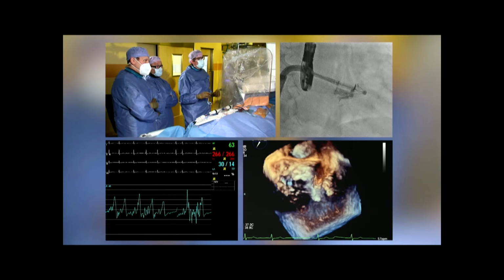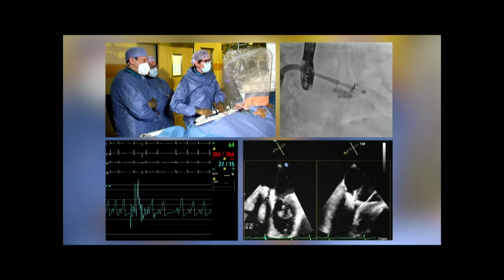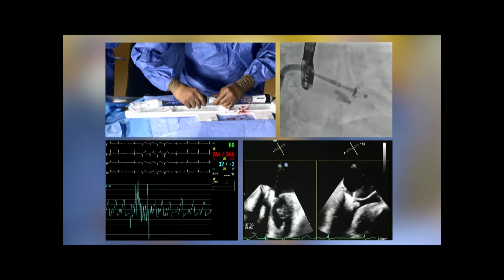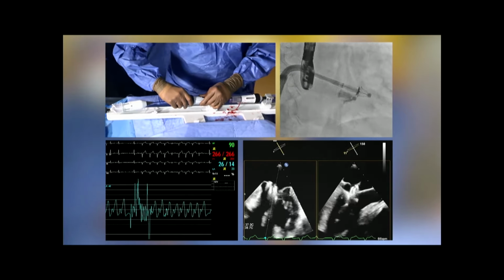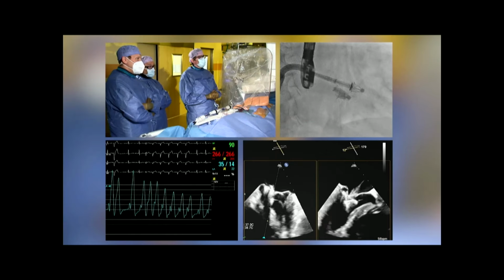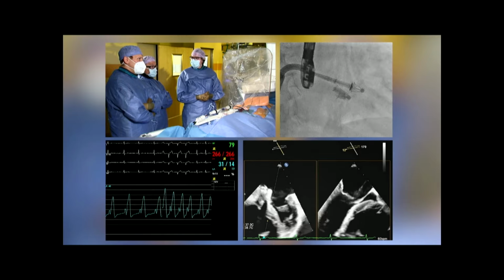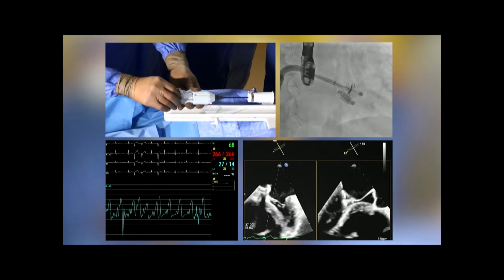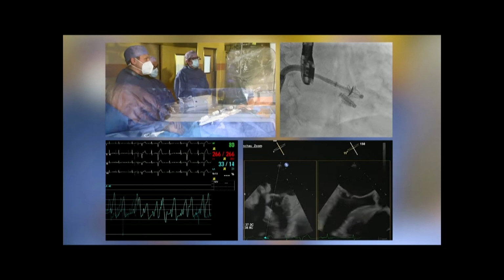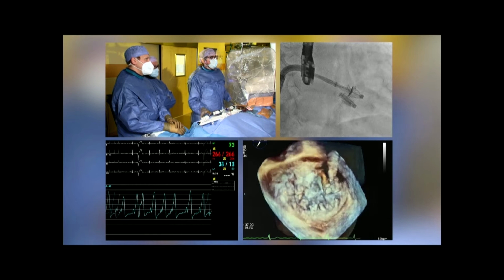Okay, orientation is fine, but not close enough. The question is if the cords will keep us away from the first device now, so that you have difficulties to swing close enough over to the first device. Okay, anterior has a lot of tissue in. Let's bring anterior down, please. And then double check on 3D for the clocking. Okay, anterior is down. We even came above the posterior now, but that's fine. We fix it in a second.